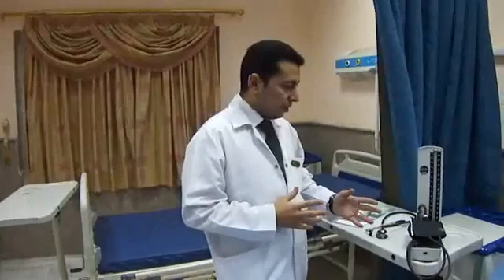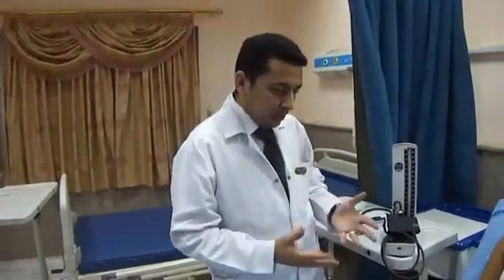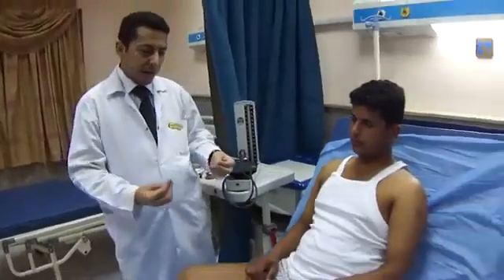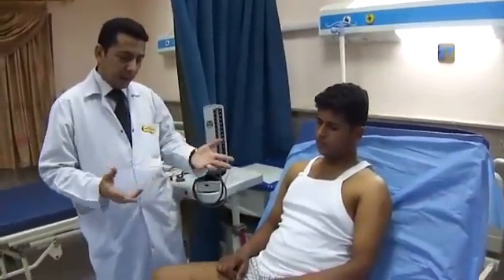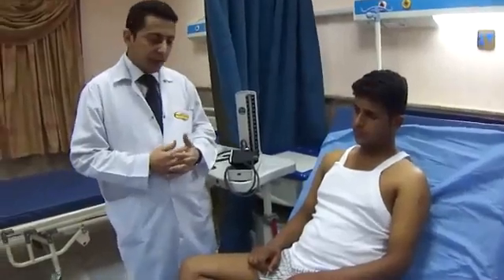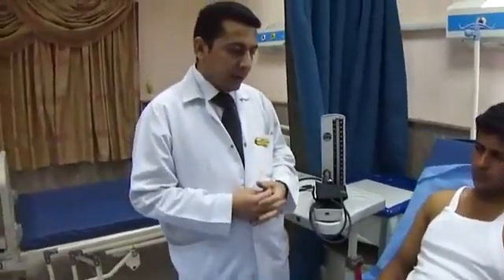First of all, I'll check the blood pressure. For the blood pressure measurement, the patient should be seated comfortably for at least five minutes, and we have to ensure that the patient hasn't taken any cigarette, smoking, tea, or coffee for at least 30 minutes prior to assessment.